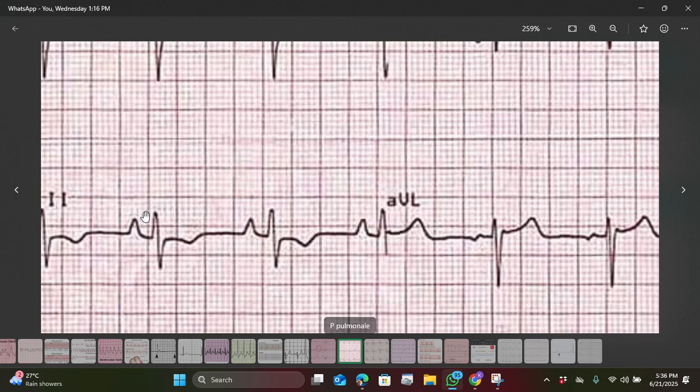Ma'am, can you please come again? Okay, let me come again. Look at this P wave that my arrow is on. If you count the small boxes in the length, this is one, this is two, this is three, and then this is four. It is kind of blurry because we are viewing it from an image. But if you actually see it, you'll be able to count these tiny boxes very well. Here there are two small boxes before this arrow and before this line, and after the line there are also about two to three small boxes. That's already like four small boxes.